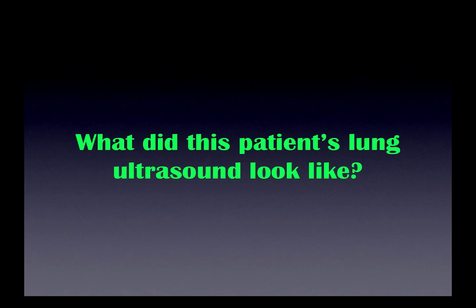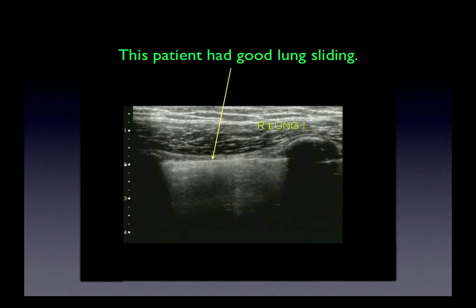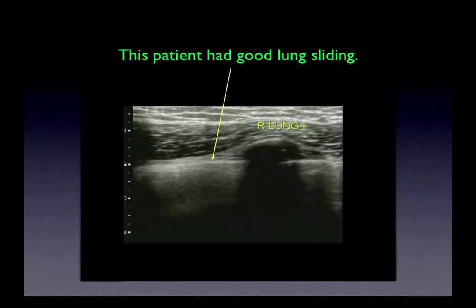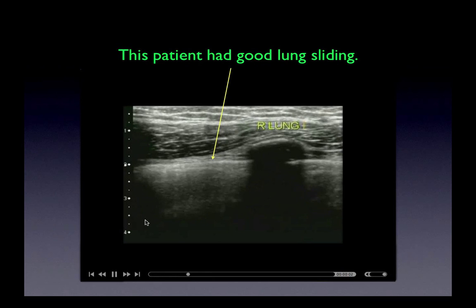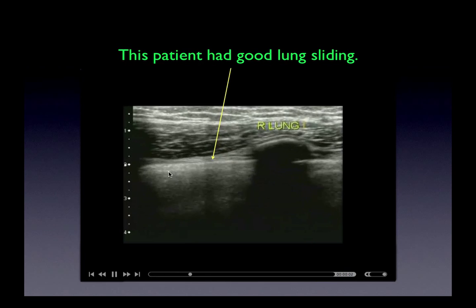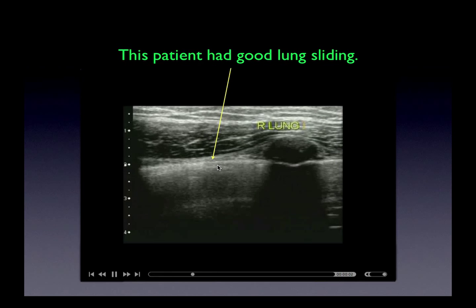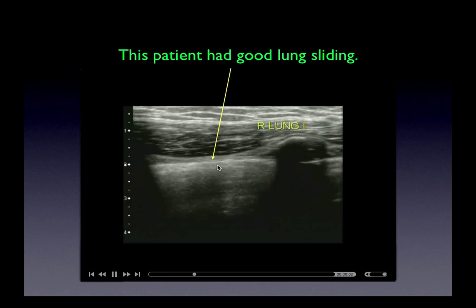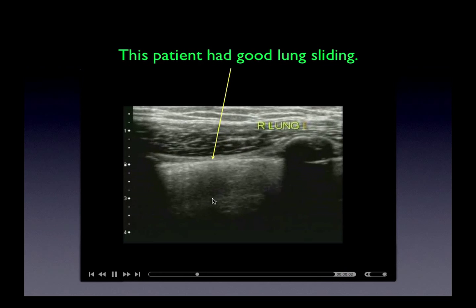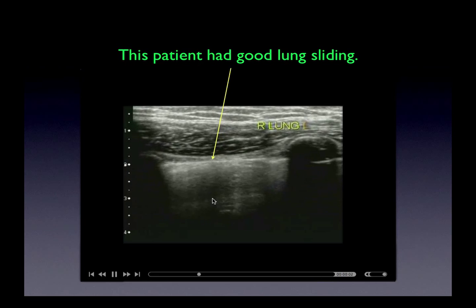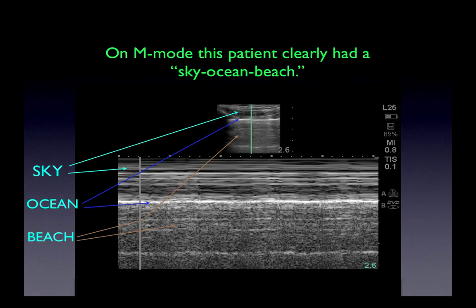So what did this patient's lung look like? The slide shown previously was actually his lung. There is good lung sliding, and there are comet tail artifacts coming down, seen in all interspaces. On M-mode, this was his M-mode — and clearly he has a beach appearance in the sky-ocean-beach. This is not consistent with pneumothorax.